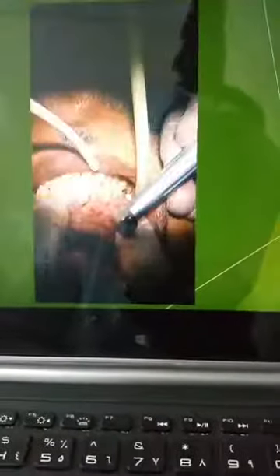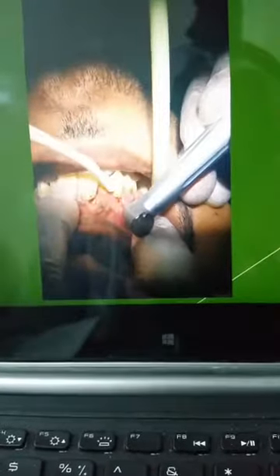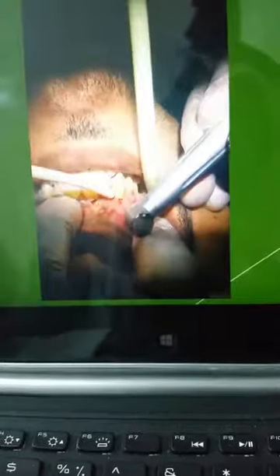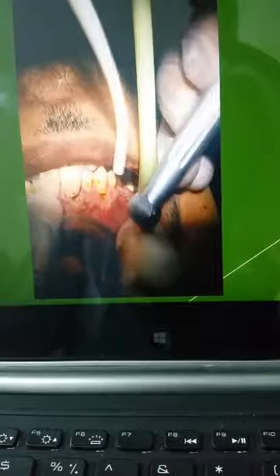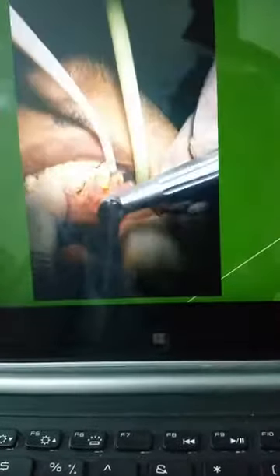This is a case I'm going to do with the erbium laser to remove the caries here. This patient is well educated, but he cannot really stand sitting in the dental chair. So we used the laser to remove the caries, and I think we did 5 or 6 teeth without local anesthesia. You can also use local anesthesia and increase the power, and very safely you can increase the erbium laser power, because it's safe to the pulp.